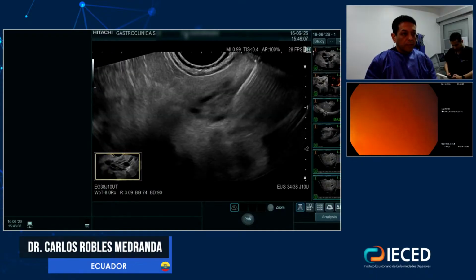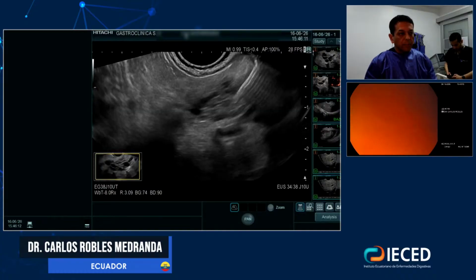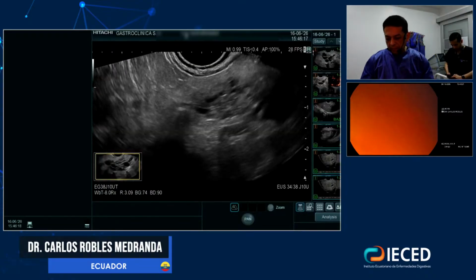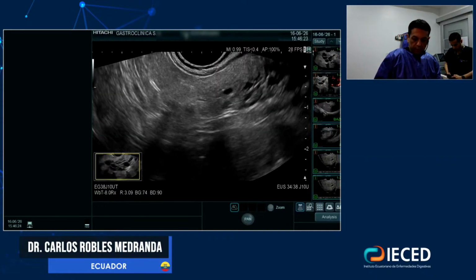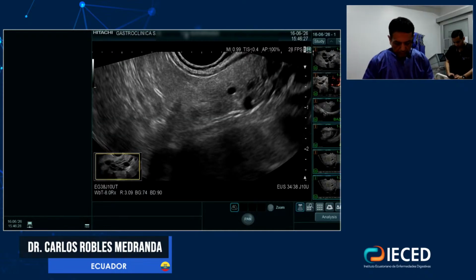Okay, so now, why do I go to the microcystic area? Because less risk of bleeding. If there is bleeding, it will be contained inside the cystic lesion. Okay, now I have everything. So well, I will show you in a few minutes just the tissue, and I will now see if there is any bleeding inside.